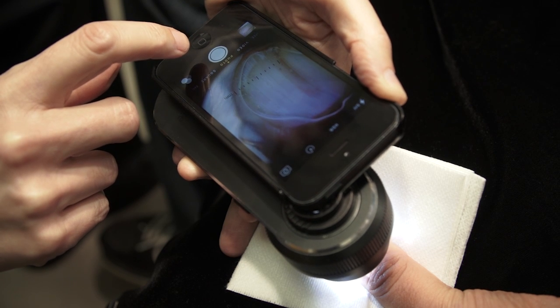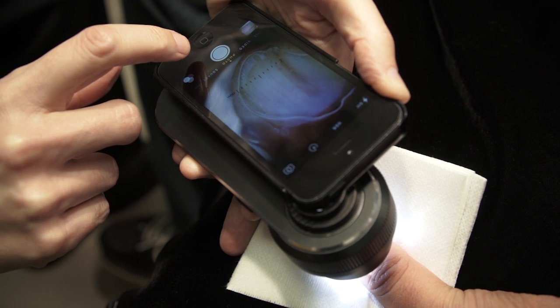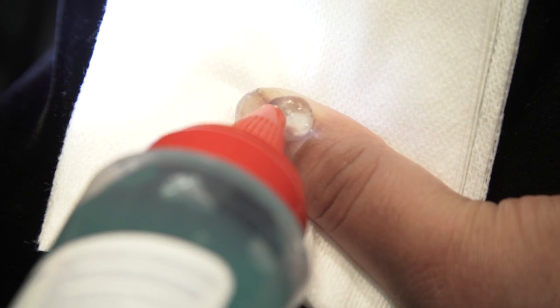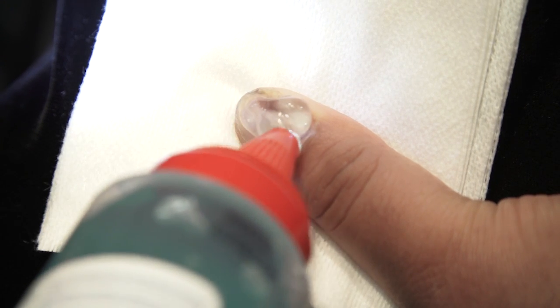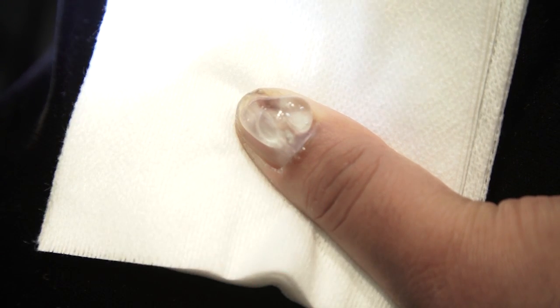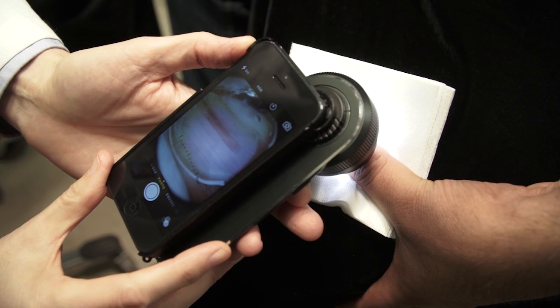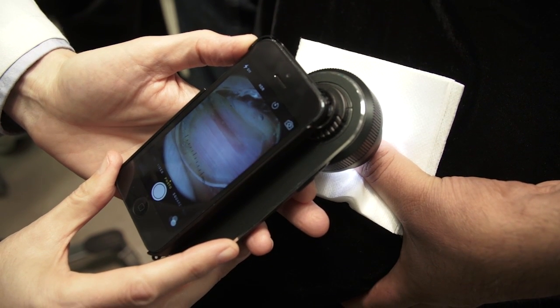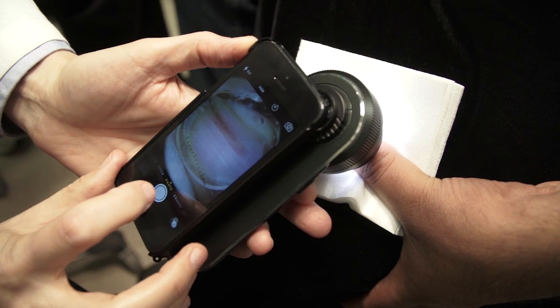Melanomas may present as a brown line in the nail called longitudinal melanonychia. Because the nail is a curved surface, it helps to apply ultrasound gel to the nail before performing dermoscopy. Melanoma of the nail has certain worrisome features that are not seen in this benign example.